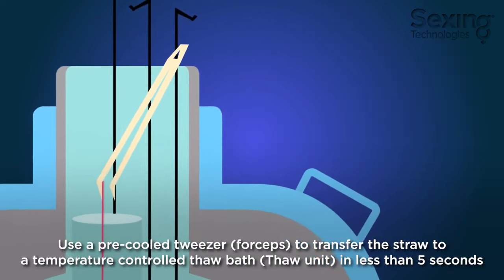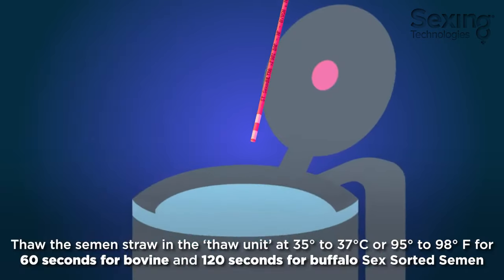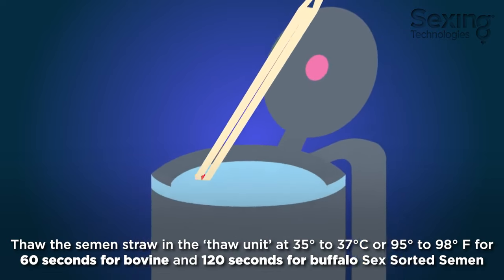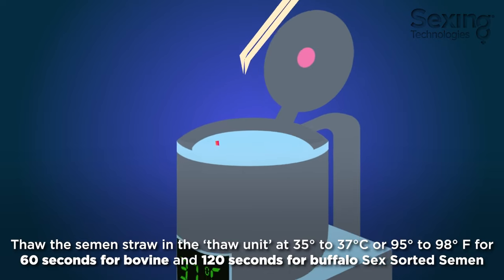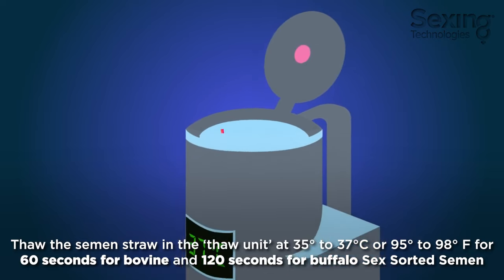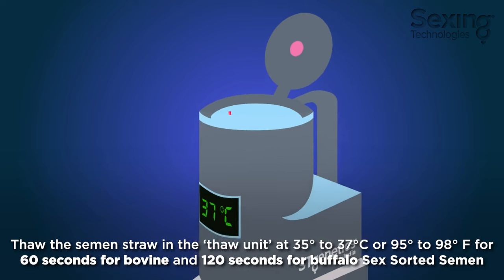Use pre-cooled tweezers to transfer the straw to a temperature-controlled thaw bath in less than 5 seconds. Warm the semen straw in the thaw unit at 35 to 37 degrees Celsius or 95 to 98 degrees Fahrenheit for 60 seconds for bovine and 120 seconds for buffalo sex-sorted semen.